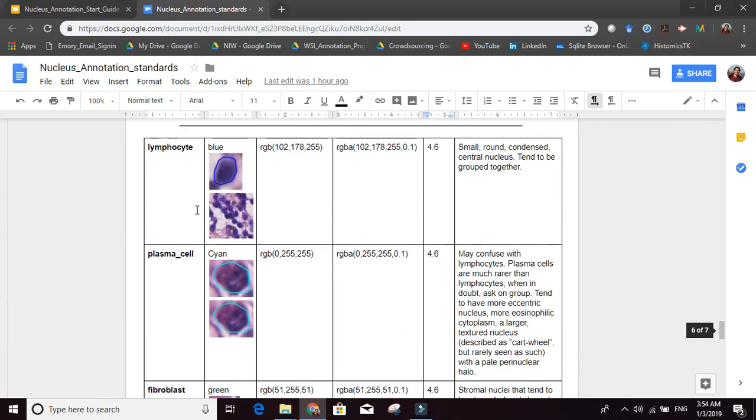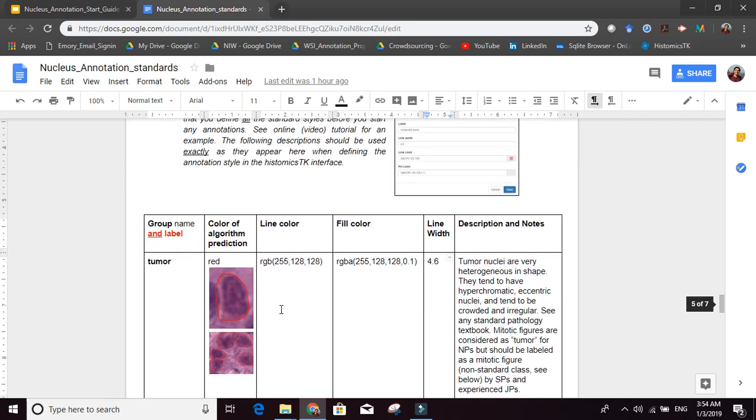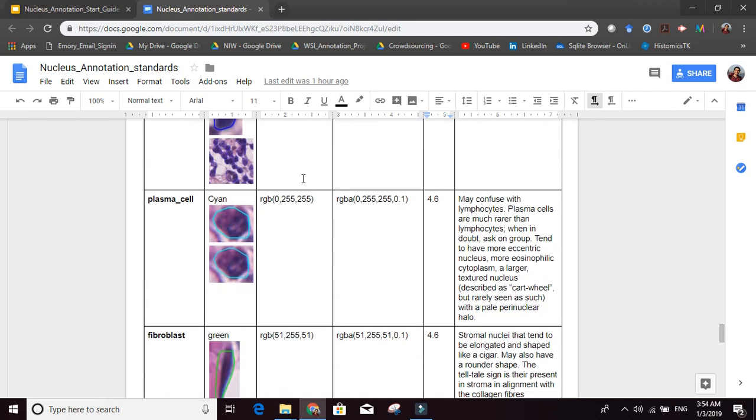So there's tumor, there's lymphocyte, there's plasma cell, there's fibroblast, and there's unlabeled. And these are basically the 5 standard labels that everyone should have. So almost every nucleus in the data set is going to belong to one of these 5 classes. Tumor, again, lymphocyte.